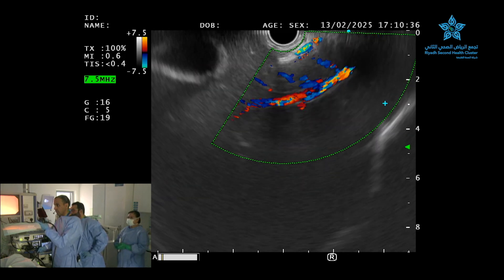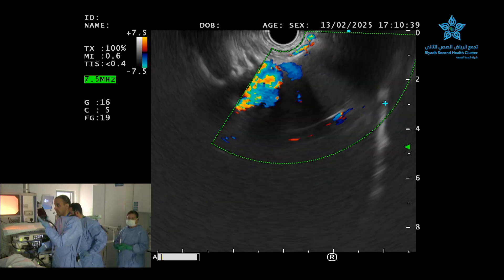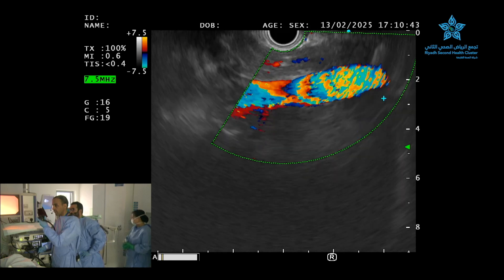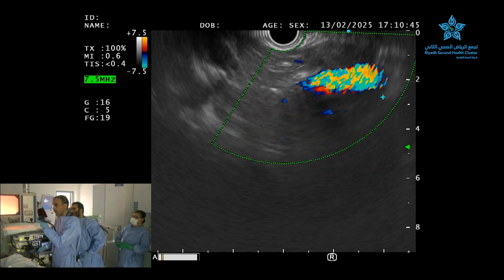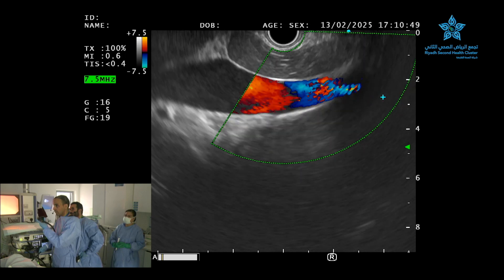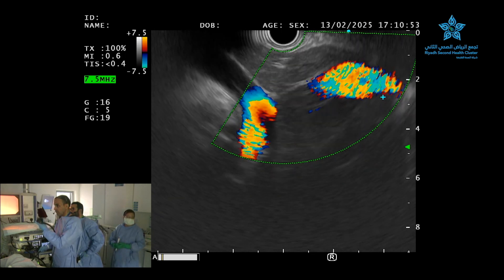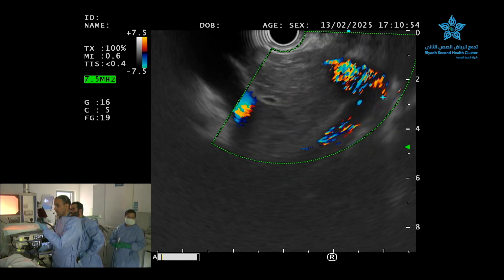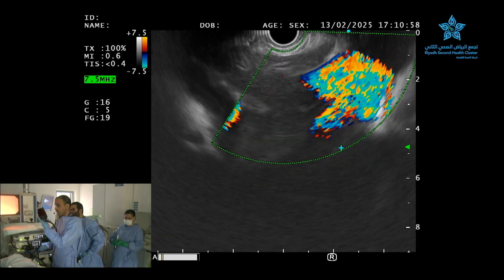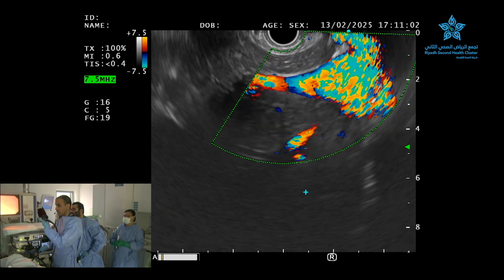When you do a liver biopsy, you put the probe and the endoscope in the bulb. We start the examination from the GE junction. We can see here the inferior vena cava opening down — you can see the cursor here. The vessel visible here is the right hepatic vein going down.